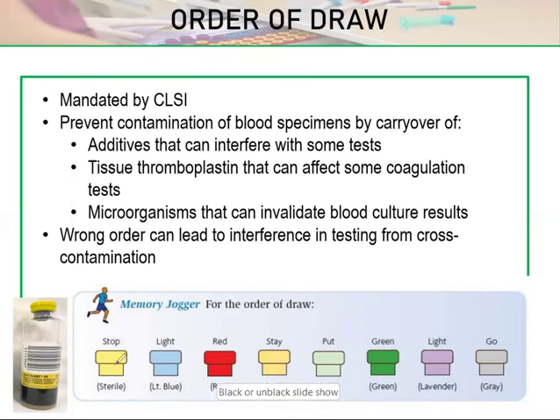So after the yellow, or the blood culture, next is the light blue for coagulation. It's because it is very sensitive. Tests with a coagulation requirement must be drawn first. Okay? And then we just have to memorize this. If you can think of a wittier or easier mnemonic, so much better. But this is what is recommended by the CLSI. These are in your references.